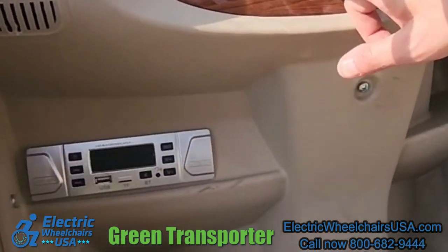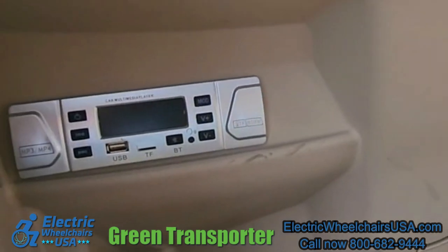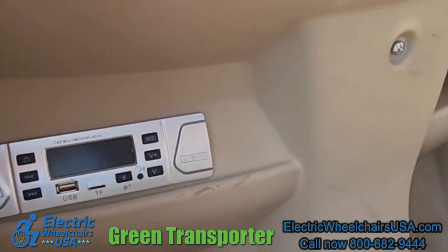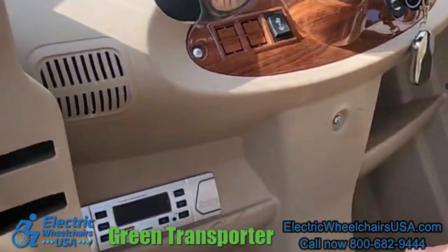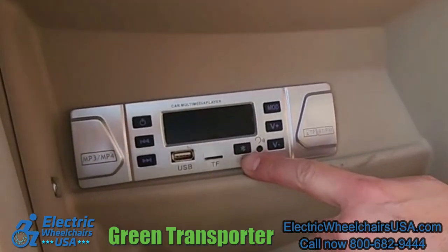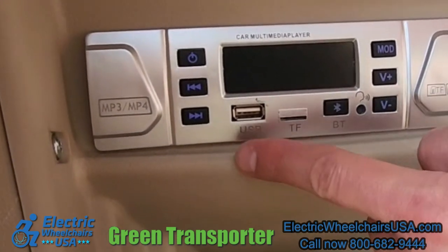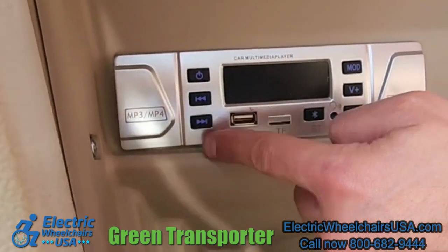There's even a defrost button, and this is a multimedia player with Bluetooth. There's a USB charging port and you can play your music through here. There's also an MP3 player, volume buttons, and of course you can turn it on and off — it's a great feature having some sound in the Q-Runner.